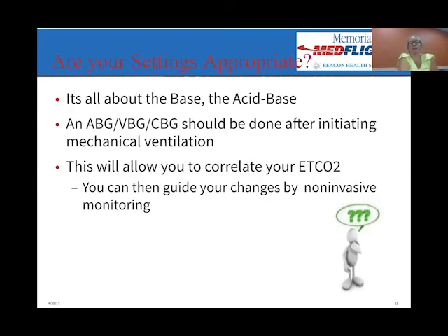How do you know if your settings are appropriate? Well, you're going to look at your ABGs. Your VBGs are not as accurate, and your capillary blood gases are not quite as accurate as ABGs, but they're very close.